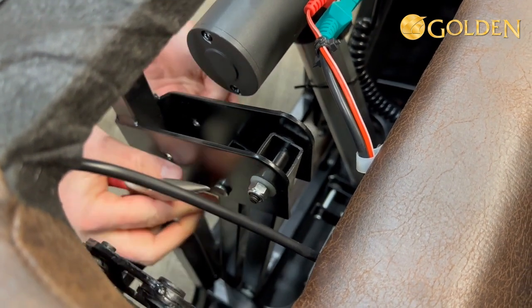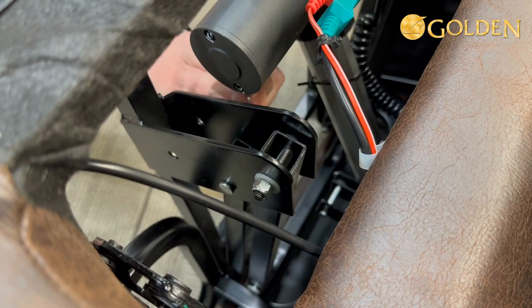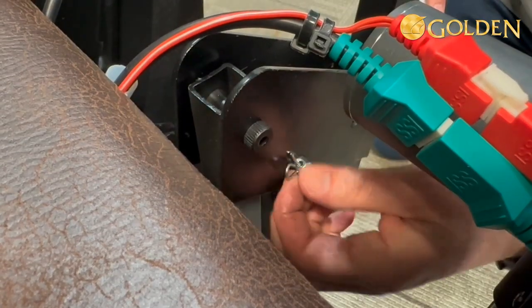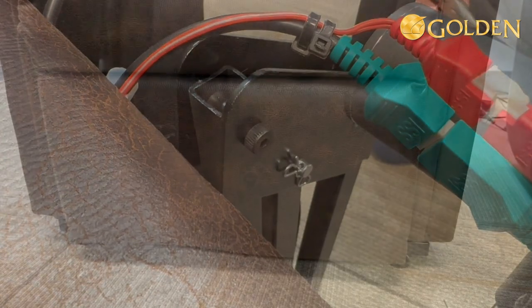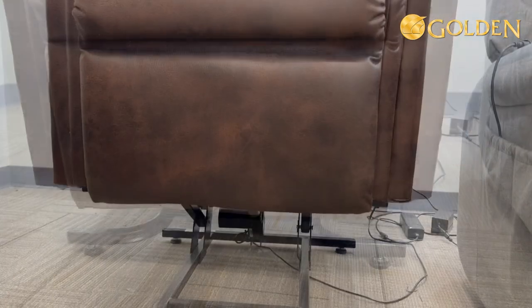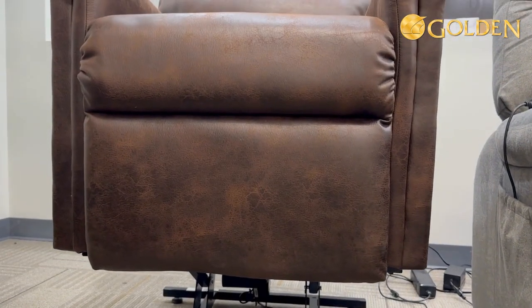Replace the pin and reinstall the safety pin. Voila!